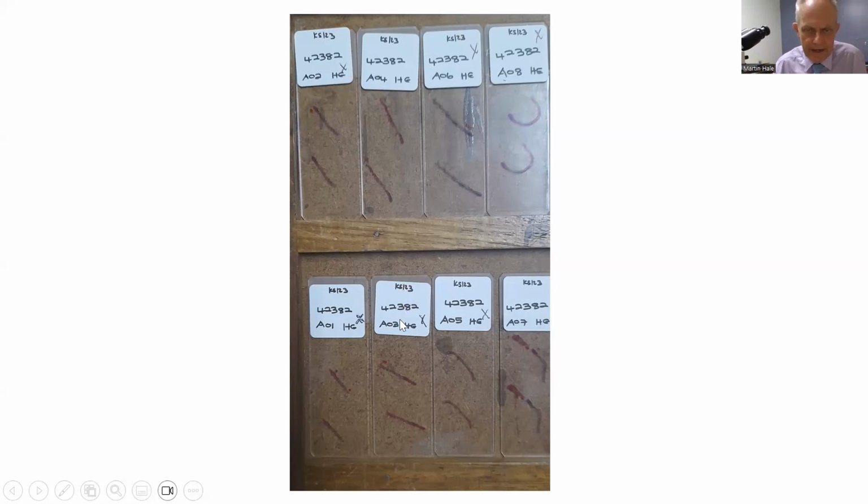And I repeat that exercise, and you need to do this. So I've got a whole lot of slides from A1 all the way through to A22. You can't see the others. And I am now forming in my mind a microscopic representation of what I can picture from a macroscopic point of view and what Vikash has seen.